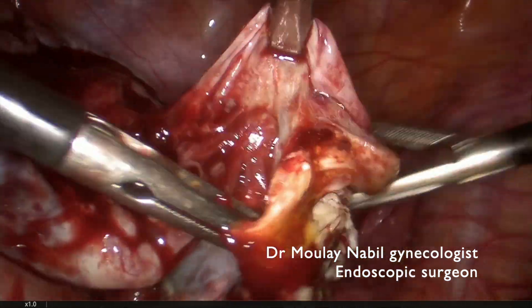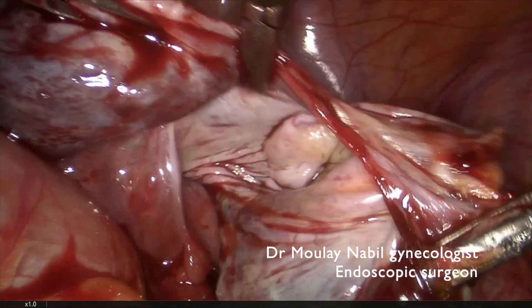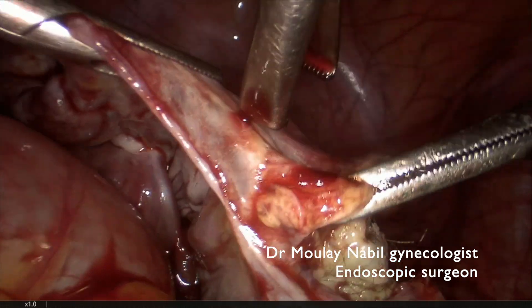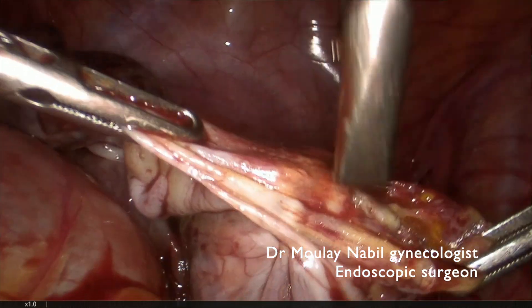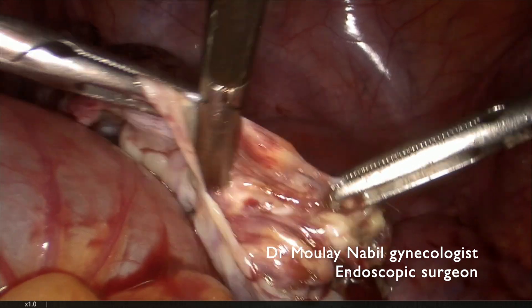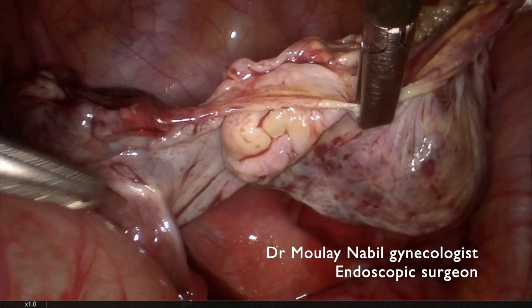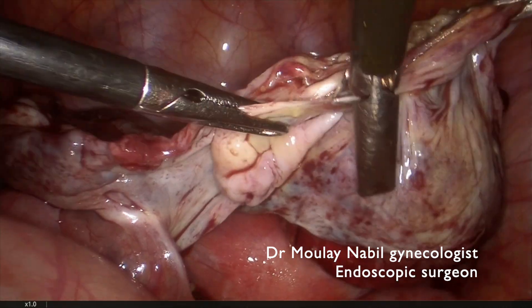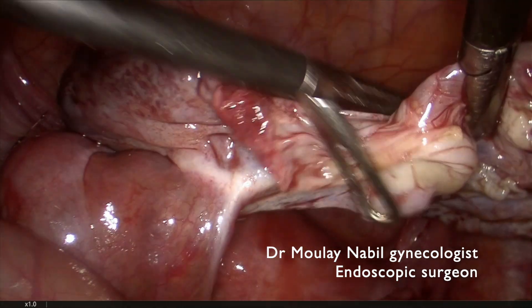It is important to always try to see the good dissecting plane. As you see, the dissection is quite simple. Even if the cyst is a little bit open, it doesn't matter. What matters is that you spare, as much as possible, the ovary and preserve the healthy one.